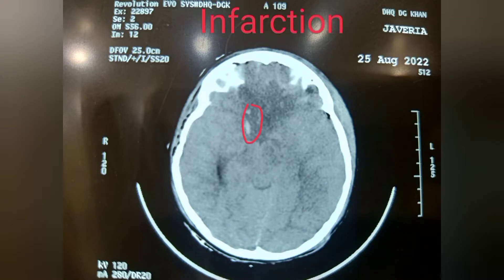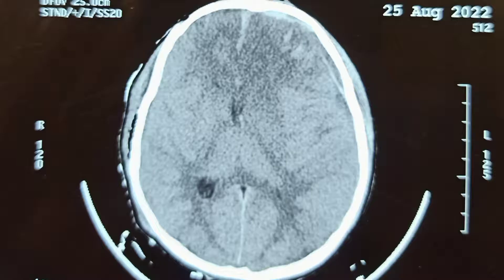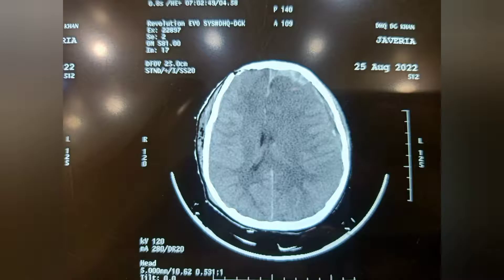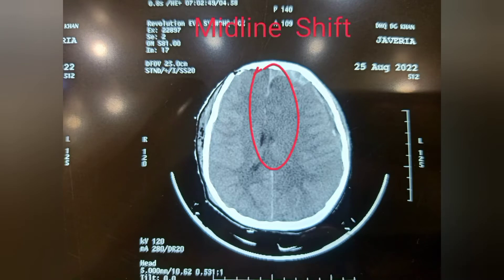As you can see on the screen, there is infarction. This is the plain film. After that, there is contusion. We will discuss each one in detail. You can also see that there is a midline shift.